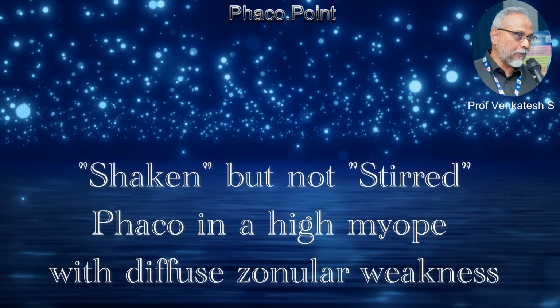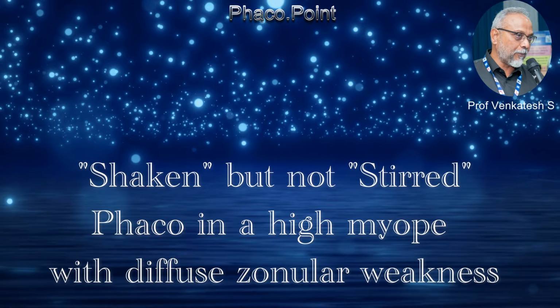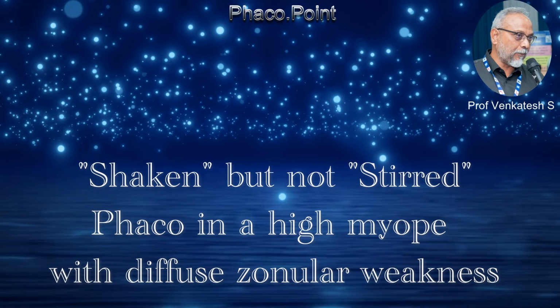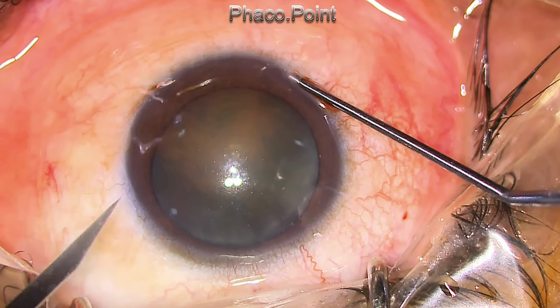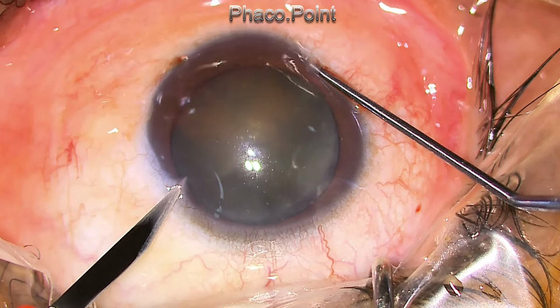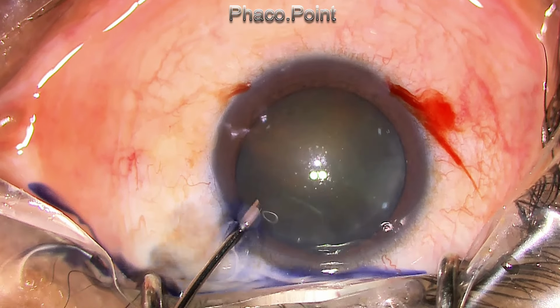Hi friends, this patient was a high myope. He had diffuse zonular weakness. He had just about a grade 1 nuclear sclerotic cataract. There was phacodonesis and iridodonesis which I could see during a slit lamp examination. He was also a moderately high myope, and this is the way I went about with phaco emulsification.